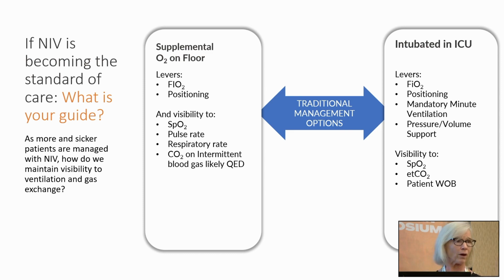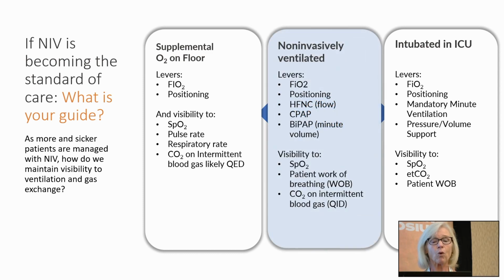You get that breath-to-breath waveform, you know if they're intubated, you know if they're extubated. So it's nice to have that, and when patients are intubated, you do have that. But more and more, we're going towards non-invasive ventilation because we know being intubated means a lot of things. It means, A, you're bypassing your upper airway, which is where we have a lot of our disease resistance. So automatically when patients are intubated, ventilator-associated pneumonia pops up on our differential, right?